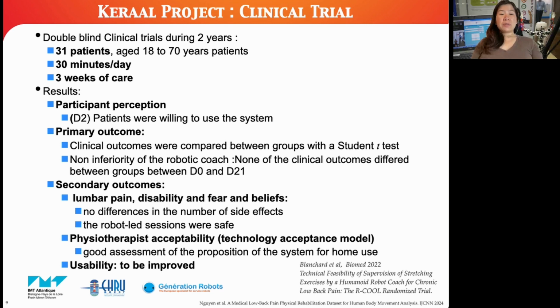In terms of participant perception, we showed through our questionnaires that the patients were willing to use the system. In terms of primary outcome, the clinical outcomes were compared between groups with a Student t-test, and it showed non-inferiority of the robot coach. So none of the clinical outcomes differed between groups if we compare between day 0 and day 21 of their care.